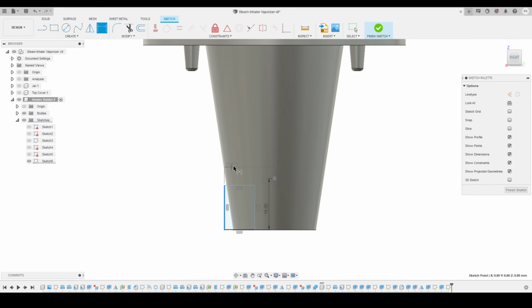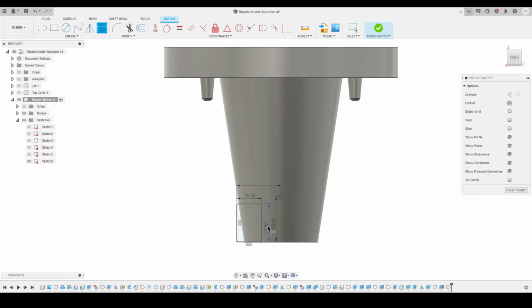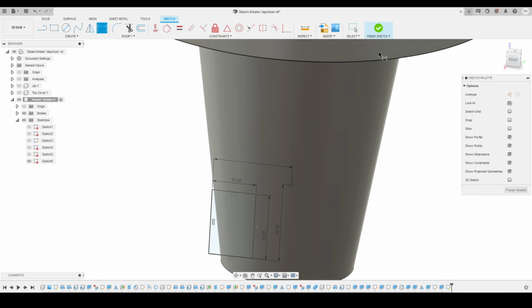Then we'll define this side, the outer side. I'm keeping 15 millimeters. So this is what we had created, or maybe we have to increase it, maybe 18 millimeters. So here you can see this is the shape we are getting. And now I will define the width of this rectangle as 10 millimeters, and the height of this rectangle I just want to keep 15 millimeters. Here you can see this is the shape we got, and if I see it from the inside, it is intersecting the body.